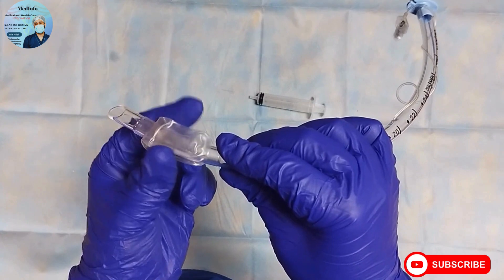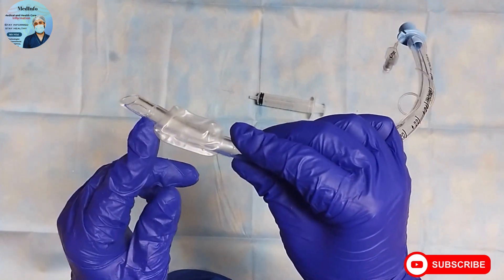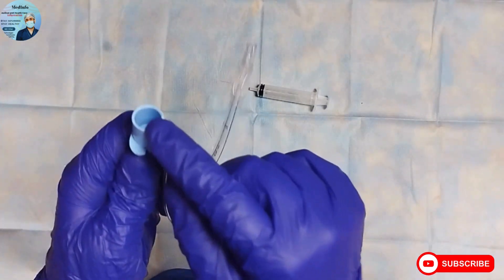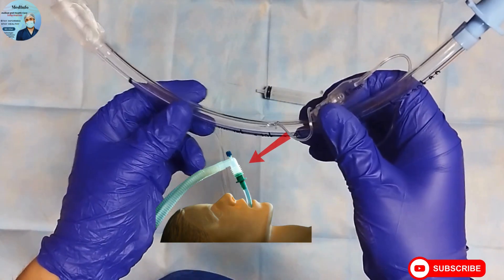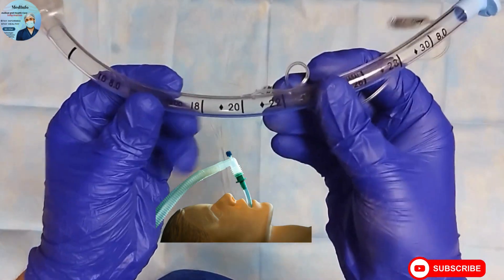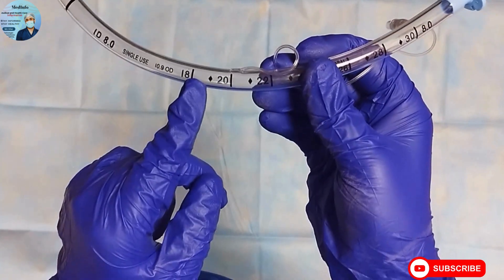This is the connector through which you can connect the endotracheal tube to the patient circuit. Now, while deciding the size of endotracheal tube, the size varies from 2mm to 10mm ID.